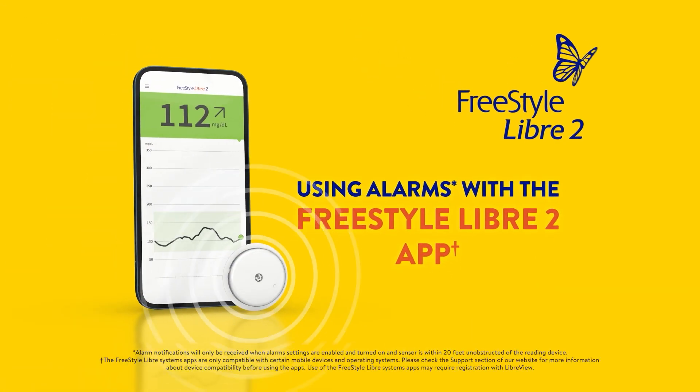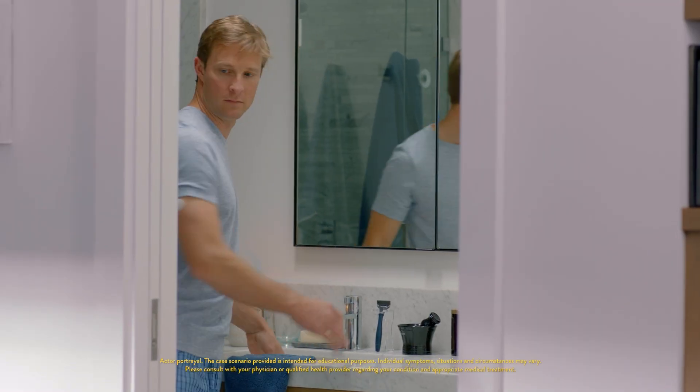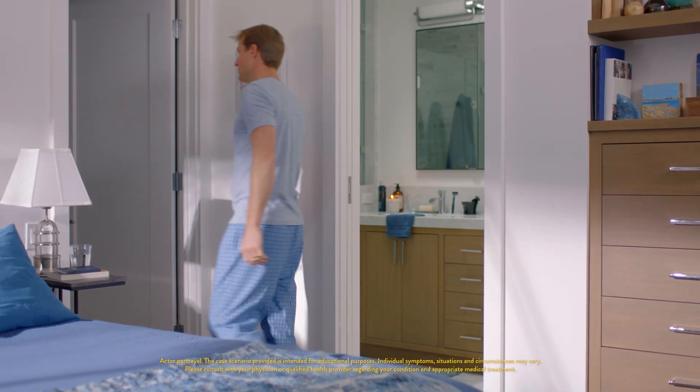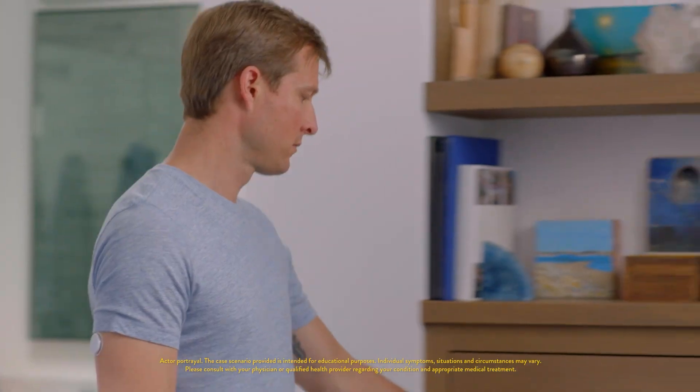This video will show you how to use alarms on your smartphone with the Freestyle Libre 2 app. I was excited to learn that my Freestyle Libre 2 system gives me the option of using glucose alarms to let me know when my glucose is high or low. Using the alarms can be a helpful way to better manage my diabetes.